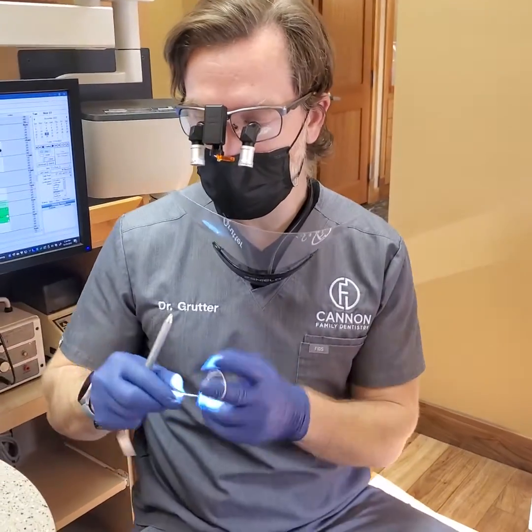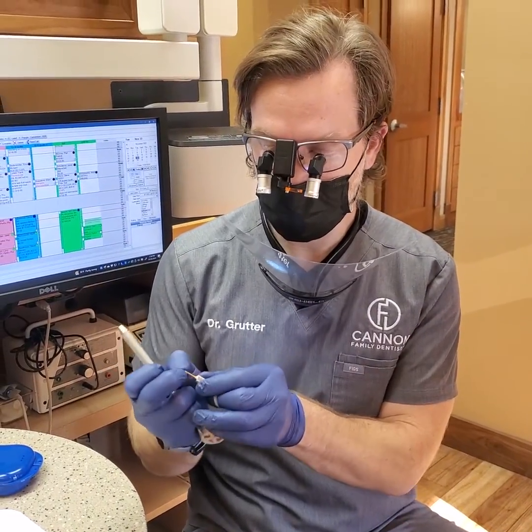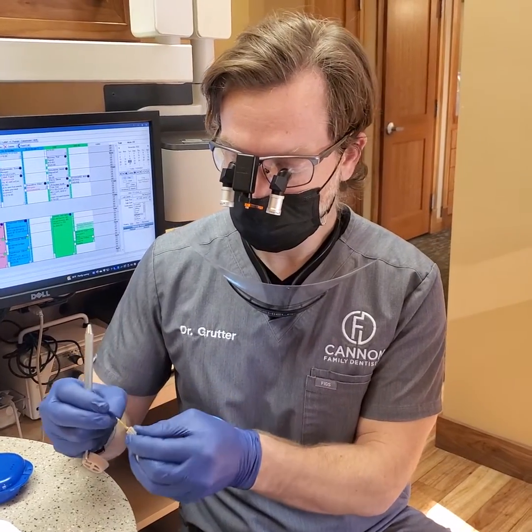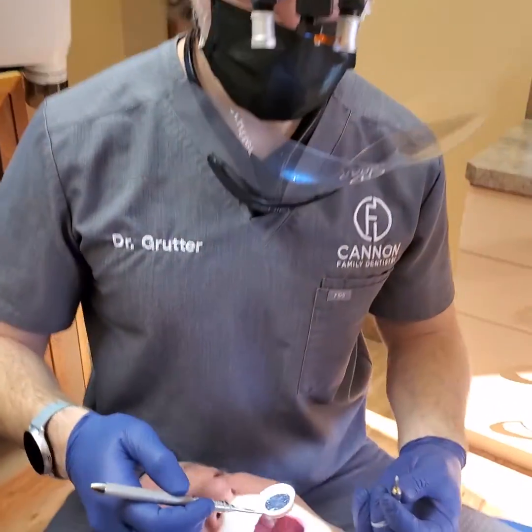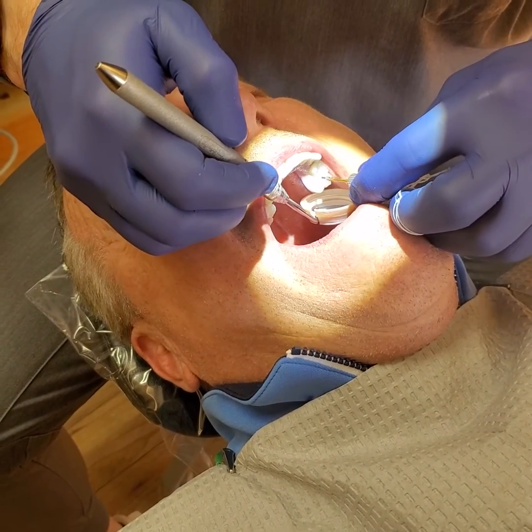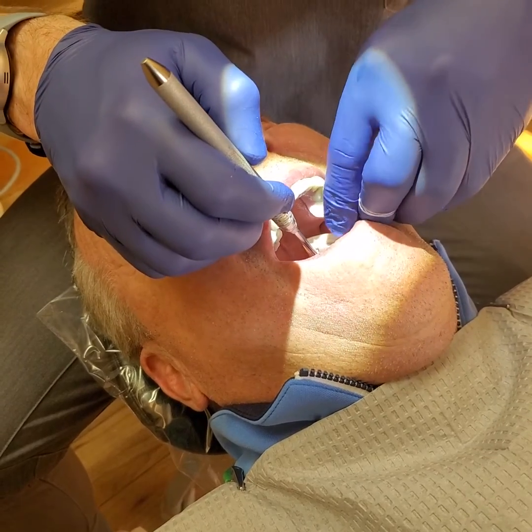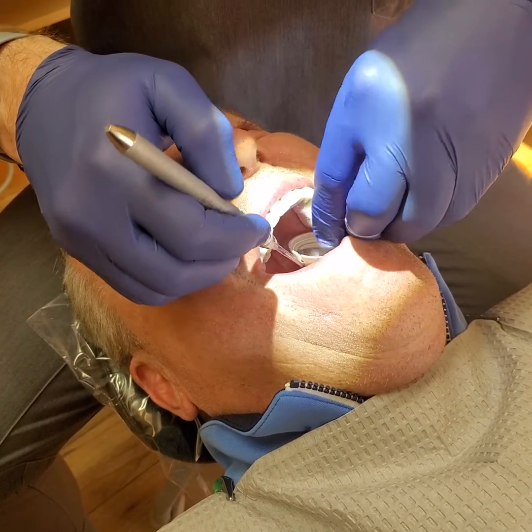I've got my little screw right here, or my driver. I'm going to load a screw. I'm going to place this inside his mouth. I am not going to intentionally simulate a drop, just so you can see how awesome it works. Hopefully you get the point.